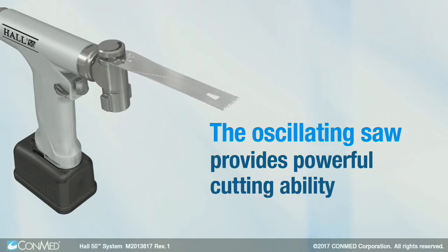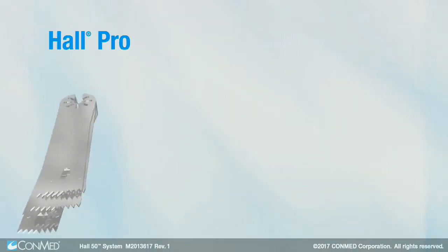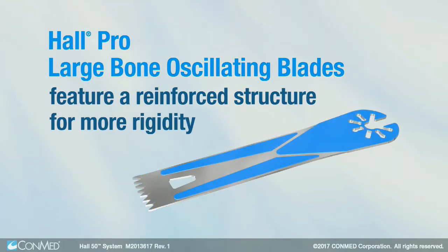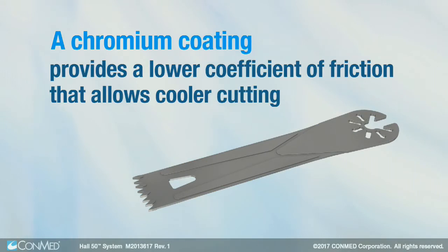The oscillating saw provides powerful cutting ability and has been engineered to generate less vibration and noise. Hall Pro large bone oscillating blades feature an aggressive tooth configuration and a reinforced structure for more rigidity. A chromium coating provides a lower coefficient of friction that allows cooler cutting.